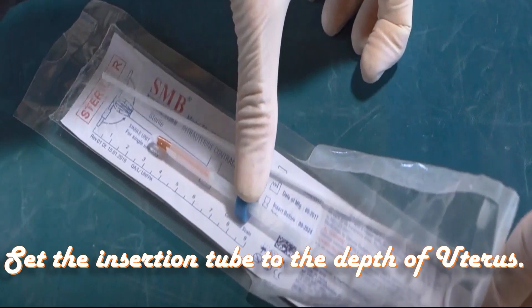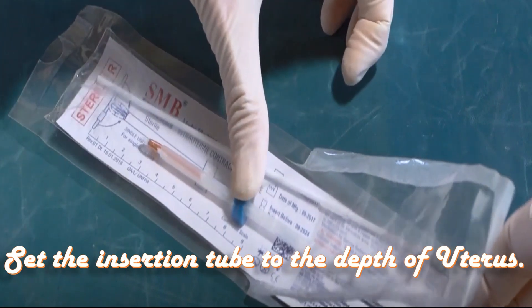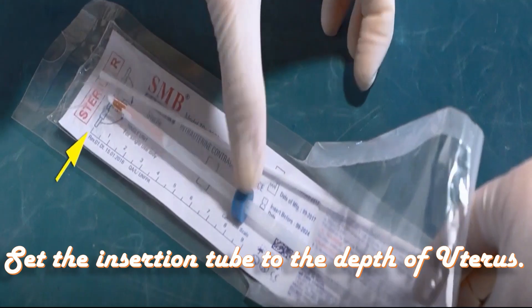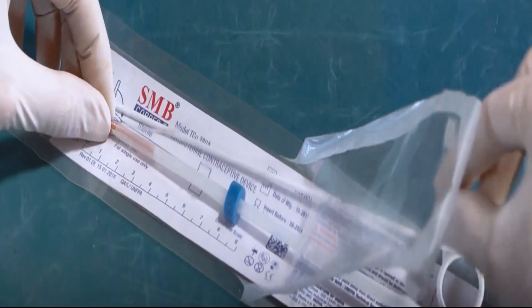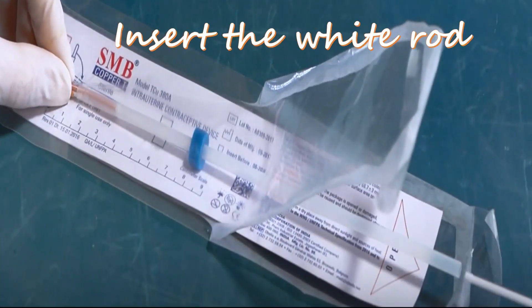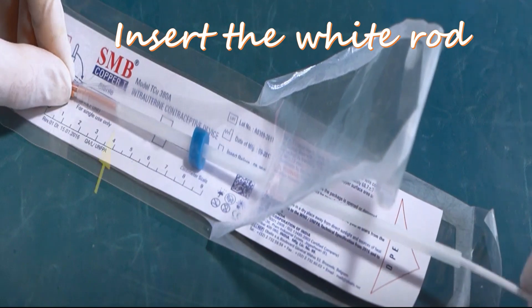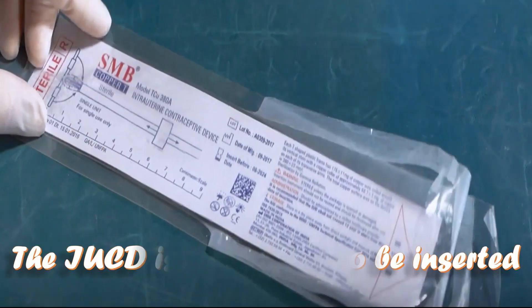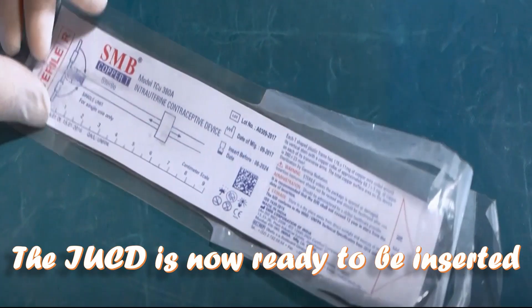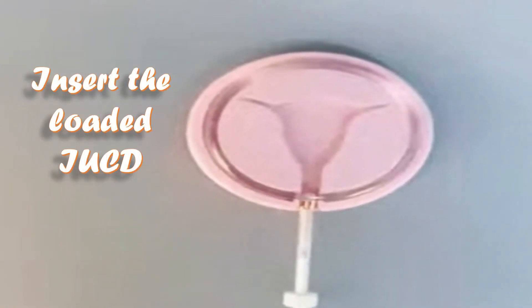As we know, we measure the size of the uterus with a uterine sound before opening the package of the IUCD. I will hold the IUCD with my fingers and insert the white rod until it reaches the end of the IUCD. The IUCD is now ready to be inserted. I will insert the loaded IUCD through the cervical canal into the uterine cavity.